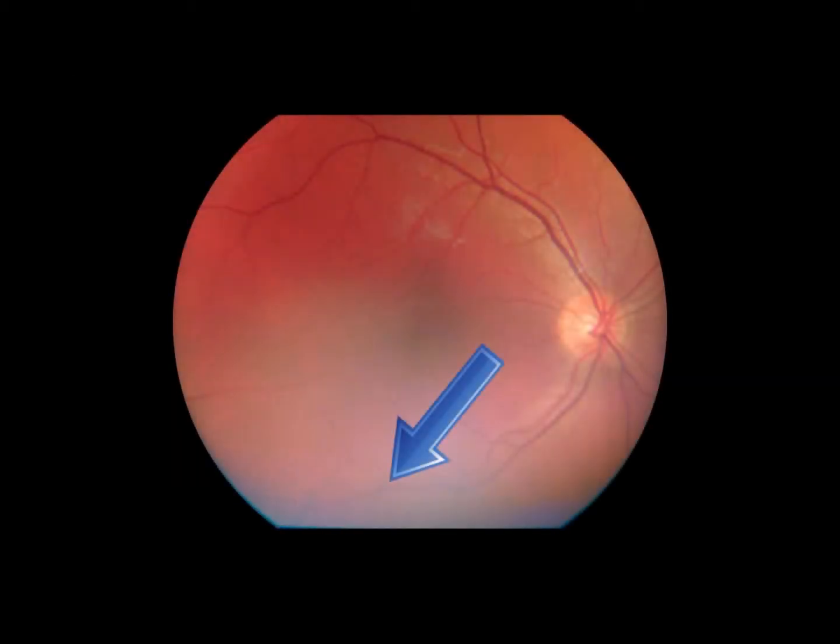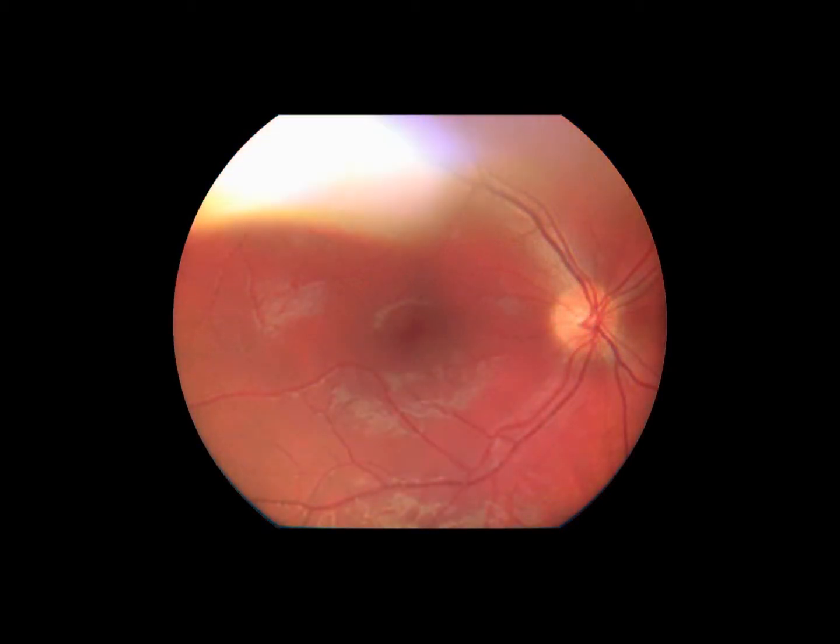If you are seeing some white light on the bottom of the image, you need to push the device slightly closer to the patient's eye. Conversely, if you are seeing white light on top of the image, then the device is too close to the eye and you need to back off slightly.